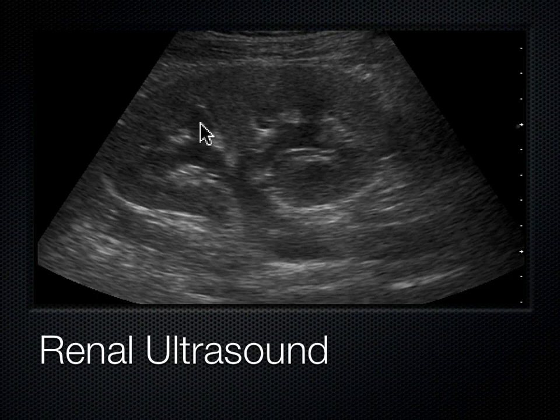And so you've got the cortex, then you've got the pyramids, and in the pyramids they look like they're basically black or anechoic because they're full of fluid or urine, and that's why they look black. And so then these pyramids, they all coalesce and drain into the renal pelvis, or sometimes you call this the sinus of the kidney. And here, this is why it's anechoic, because there's more fluid coming there, and then eventually they exit out the kidney and into the ureters.